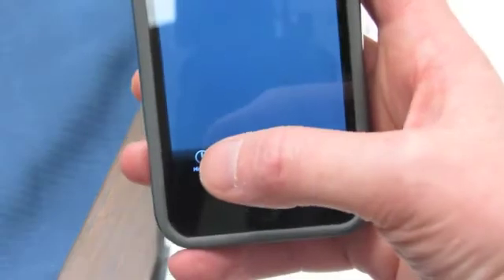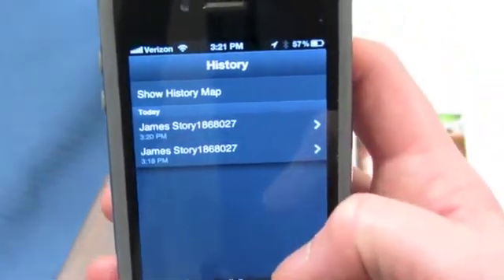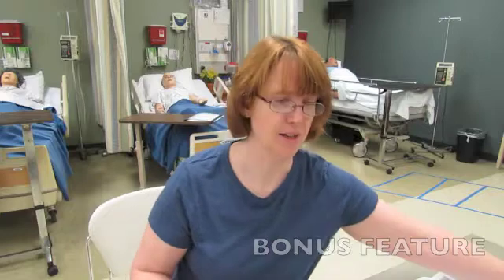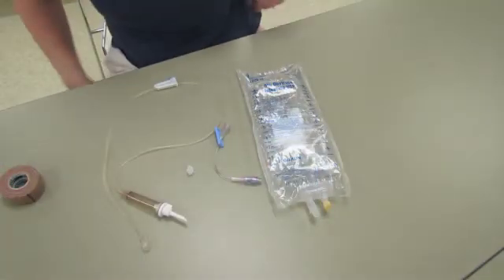Then what I do is look at my history, and then I can see that the same ID and patient name have been scanned twice. Now the other little nifty trick that we'd like to share with you today is how we do IV solution drainage system.